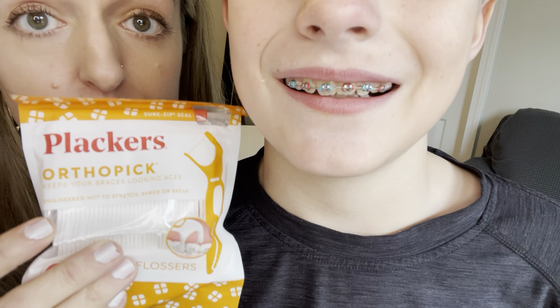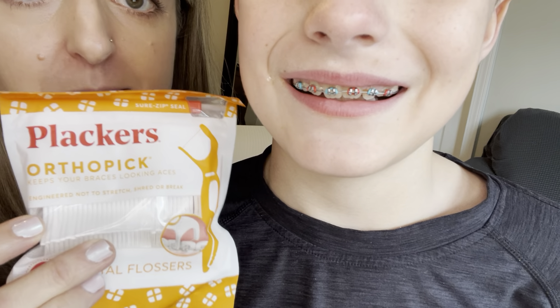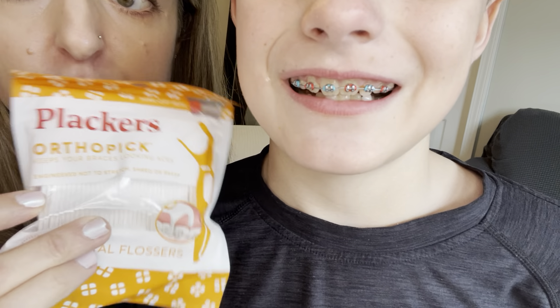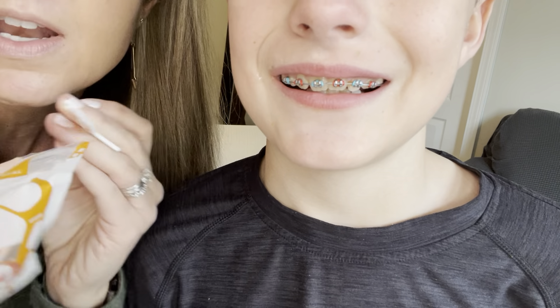These are Placker Ortho Picks — special dental floss sticks for using with braces. This is a new unopened pack, and here is our current pack. I just want to show you that it has a handy little zipper on it, so you can store these right on your countertop or in your vanity drawer and they will stay clean.